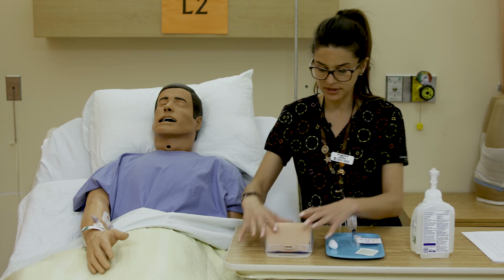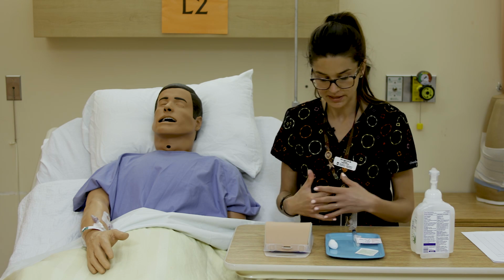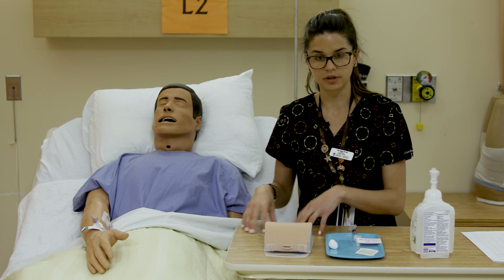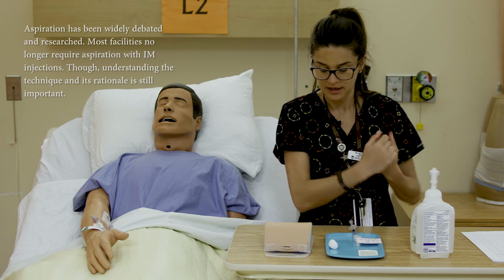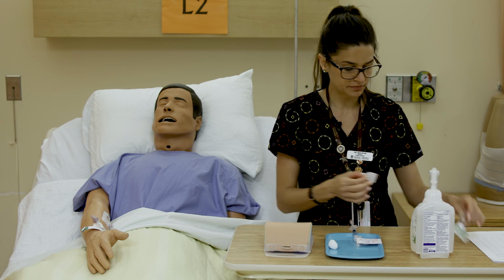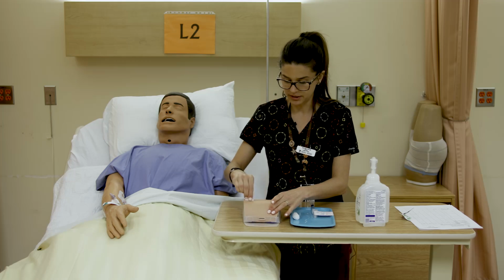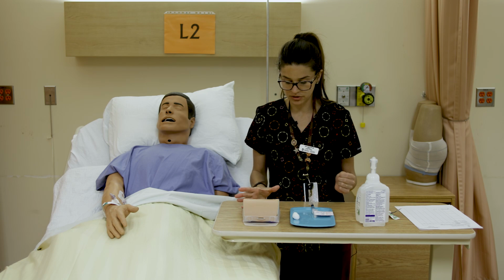If we are doing this in the ventrogluteal site and our agency dictates that we Z-track and aspirate because we're not giving a vaccine, then we'll show that so you understand how to do it, and you can adjust your practice accordingly per facility. So again, gloves if preferred, and clean hands. We're going to clean our site with alcohol, have a cotton ball ready to go, and once we've landmarked our site, we're going to clean it again in that circular motion, a big area, about 5 centimeters out is good, and let it dry.